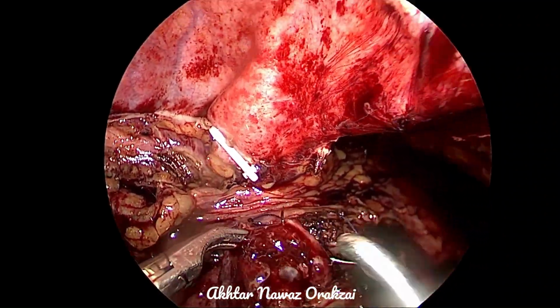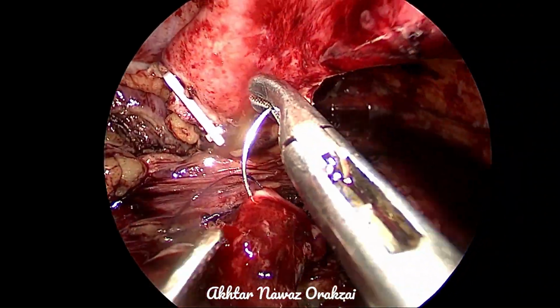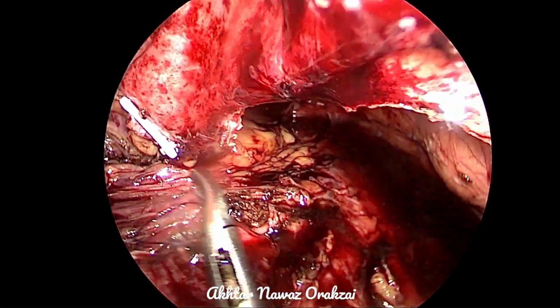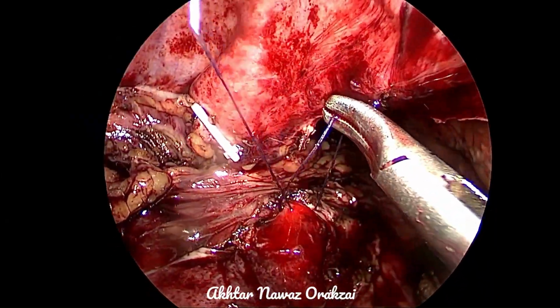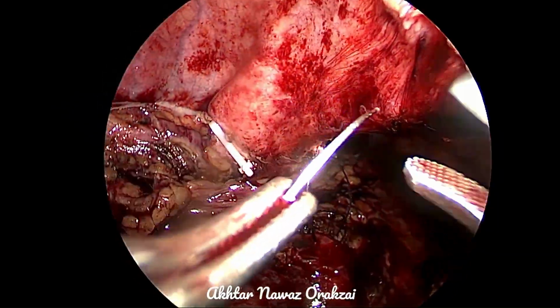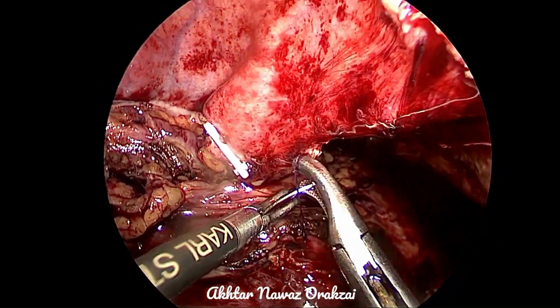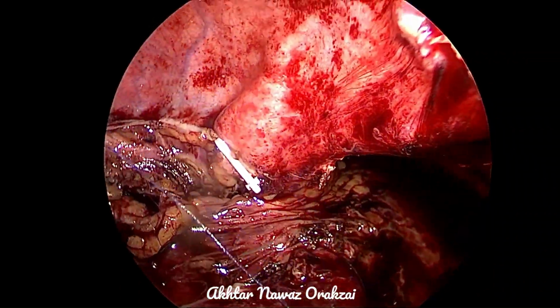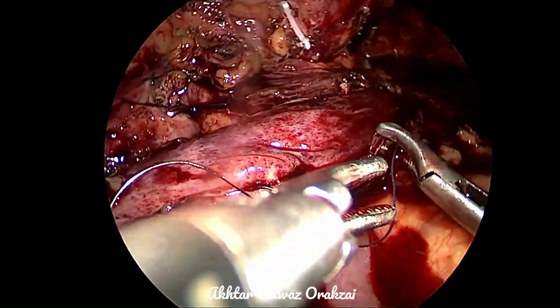So, inside out, and the loop is outside, and we will just bring it through the loop and tighten it.